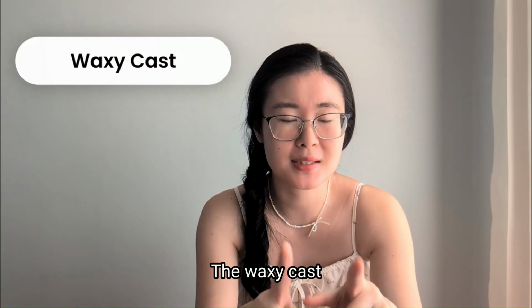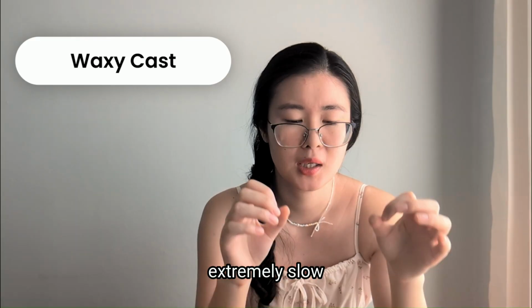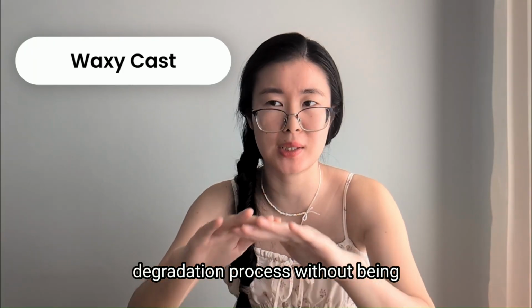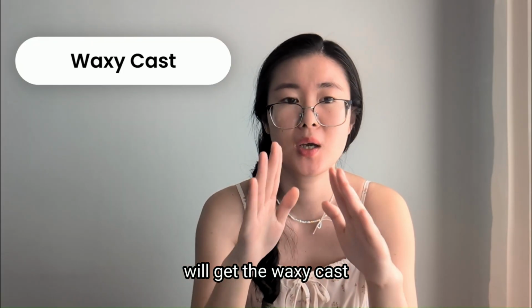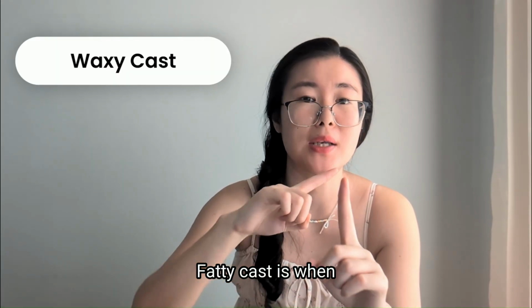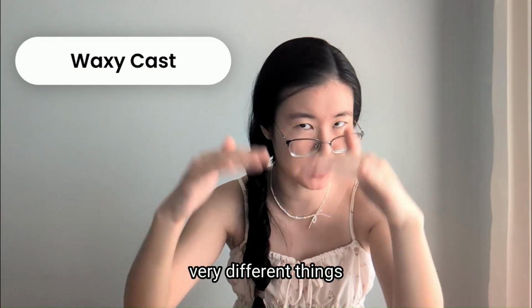The waxy cast, on the other hand, is caused by when your urine flow is extremely slow and the older cellular or granular casts just keep going on their degradation process without being peed out. That's the time you will get the waxy cast. Waxy cast is the one with blunted ends, very smooth looking. Fatty cast is the one where you see the cross structures under polarized light. So they are two very different things.